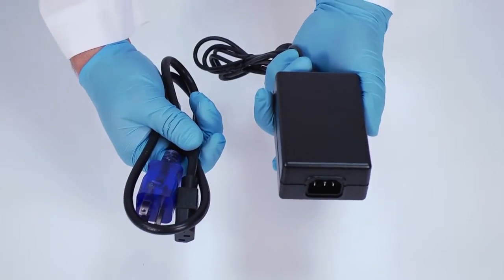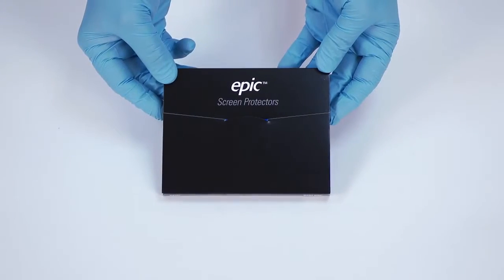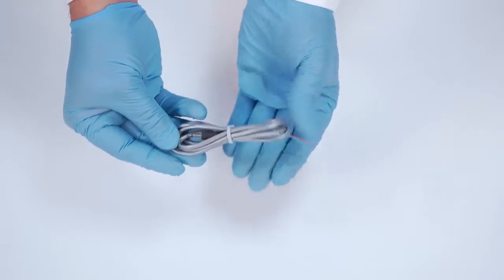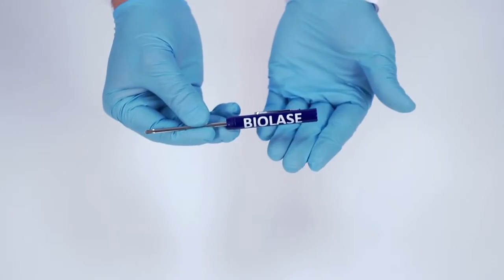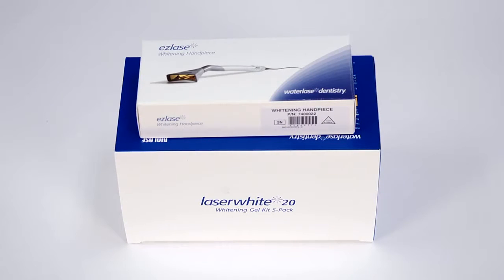Power supply and cord for EU and North American countries. Screen protectors for the EPIC touchscreen. Remote interlock cable. Phillips head screwdriver for replacing foot switch batteries. If you ordered a whitening handpiece or deep tissue handpiece, these items are shipped in separate packaging. Please consult the EPIC user manual for additional instructions.